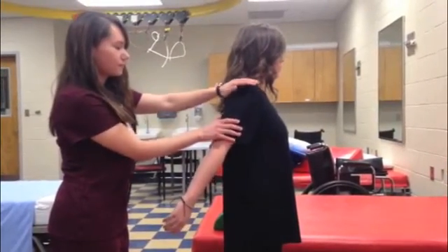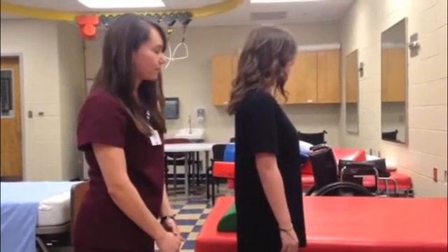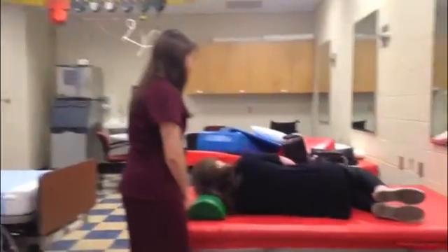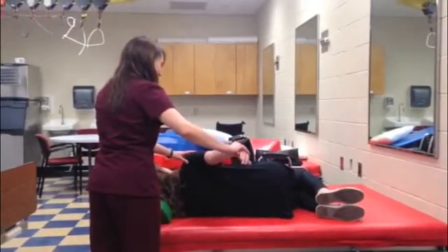If the patient is able to tolerate this without problems, they would receive a grade of 5 or normal. If the patient cannot actively perform this motion against gravity, instruct them to lay on their side to eliminate gravity. If they can now perform this motion while laying down, they will receive a grade of 2 or poor.